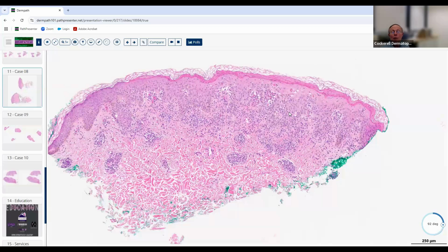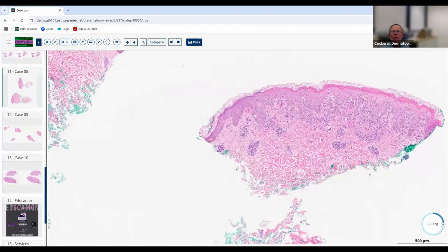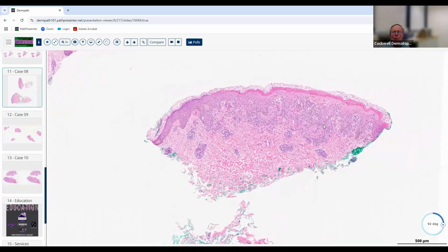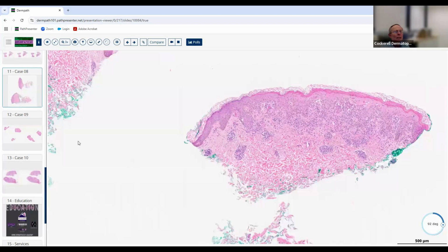So a beautiful example of Pityriasis lichenoides, probably a fairly early lesion since it still has the basket weave cornified layer on it. Not too many other teaching points on this. Lymphomatoid papulosis can sometimes look similar. Usually that's going to give you more epidermal necrosis and you get the atypical lymphoid cells here. We don't really see any of that in this condition. So a pretty straightforward example of Pityriasis lichenoides.